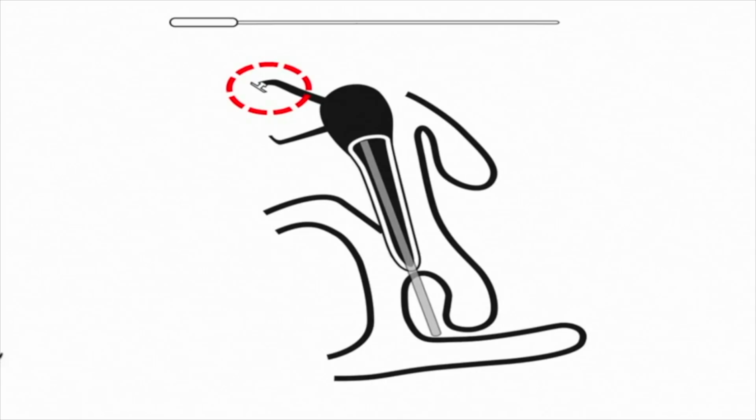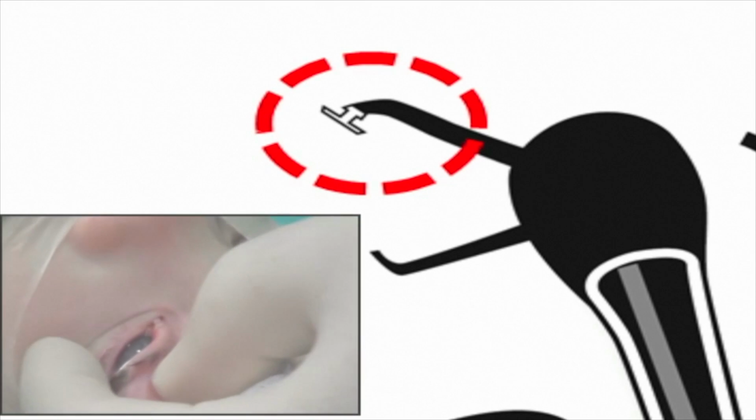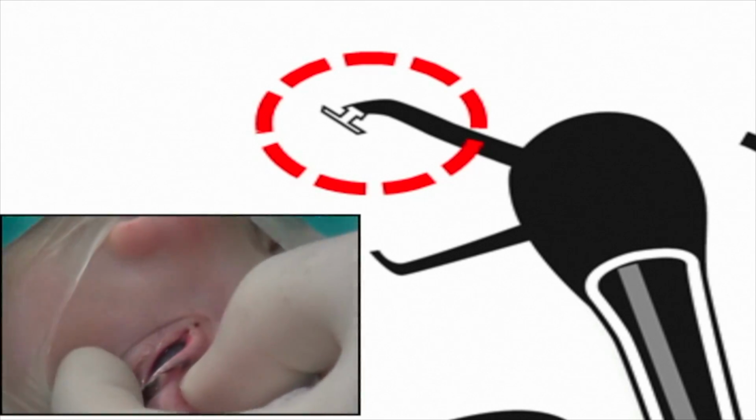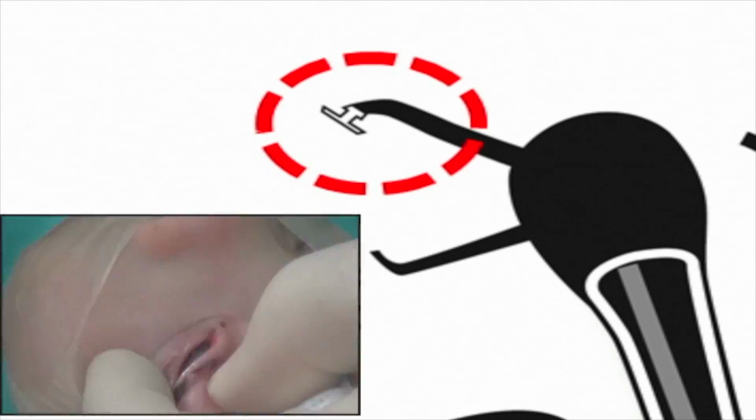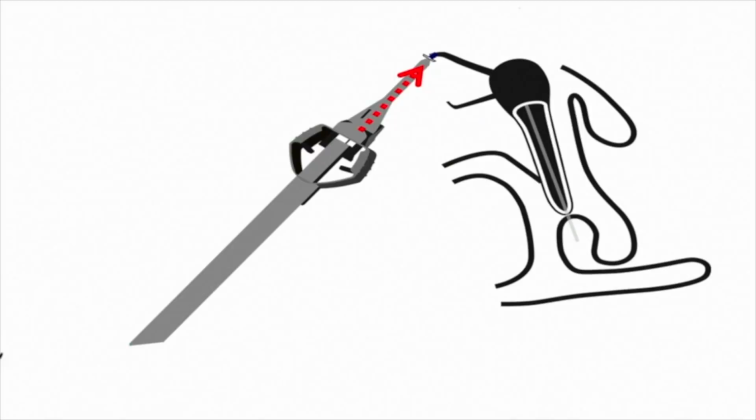The rotating movements should be continued until the insertion guide has been completely removed. It is then essential to check two things. First, that the fixation head remains in close contact with the punctum without having a tendency to pop out, and second, that it does not pass through the punctum and become buried in the canaliculus.